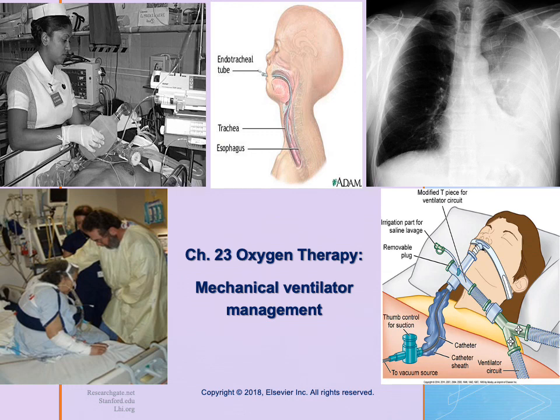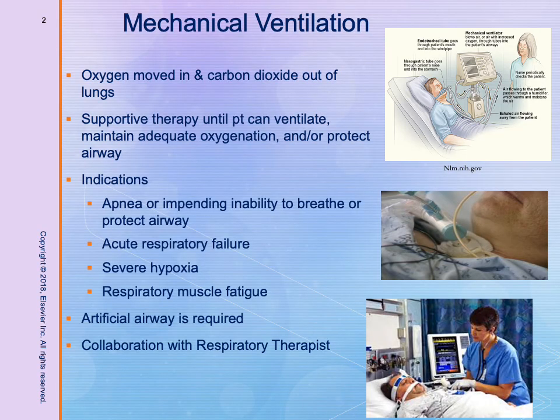Today's content is oxygen therapy with a focus on mechanical ventilator management. This content comes from Chapter 23 in your Clinical Nursing Skills and Techniques textbook. This is intended to be a basic introduction to mechanical ventilation.